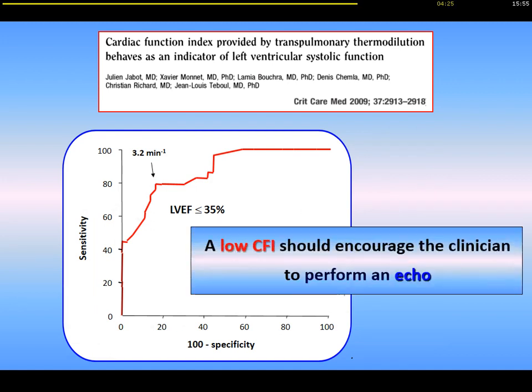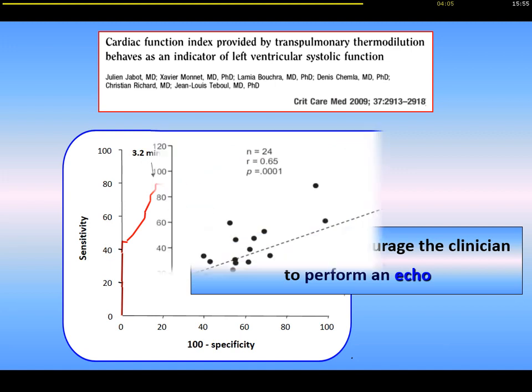So in our unit, we use CFI as a warning variable, and when we have a low CFI, we are encouraged to perform an echocardiography to confirm first, but also to try to find the mechanism responsible for this decrease in systolic function.